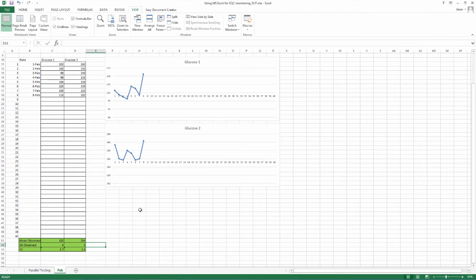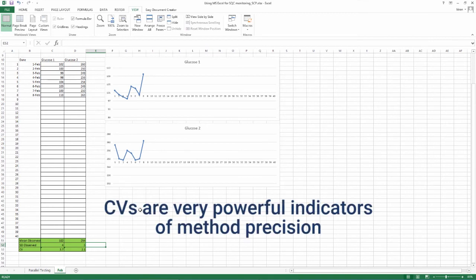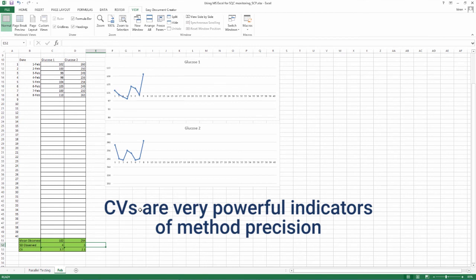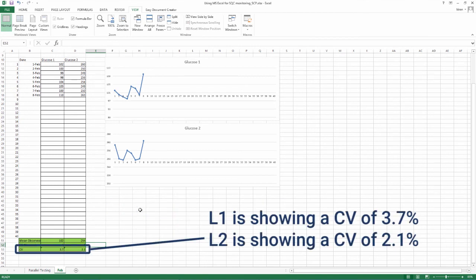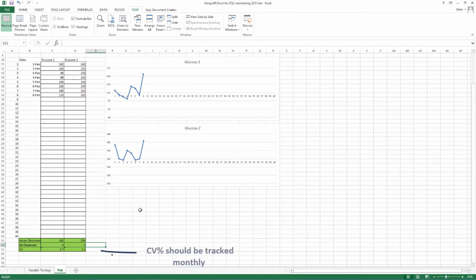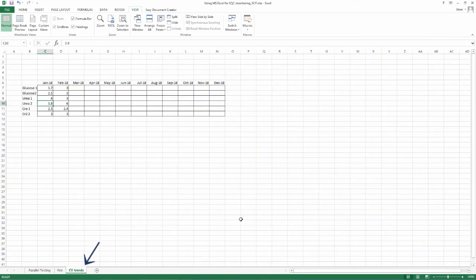As we learned in the earlier videos, CVs are very powerful indicators of method precision. And, as it is expressed in percentages, the comparison becomes very easy. Month to month, parameter to parameter, lab to lab, lot to lot and so on. Here, glucose L1 is showing a CV of 3.7% and L2 2.1%. This indicates the precision of the method, L2 being more precise than L1 at this point. The CV percentage should then be tracked on a monthly basis to allow quality monitoring of the lab as CVs are very powerful quality indicators.